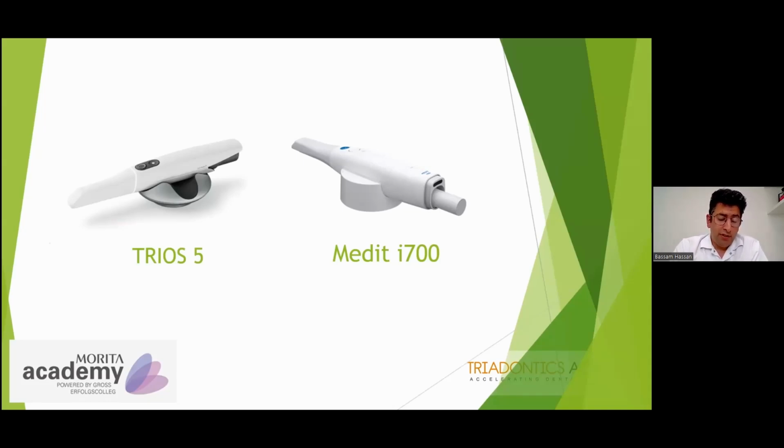But then with the introduction of the Trios 5, the workflow is completely open now with the new software installation. And although it still has a few kinks to straighten out, as they say, or some issues with the workflow, I still prefer the Medit workflow more or less. But the reliability of the Trios and the amazing stitching quality of dental scans, going through blood, going through sutures, going through stitches, really is imposing.